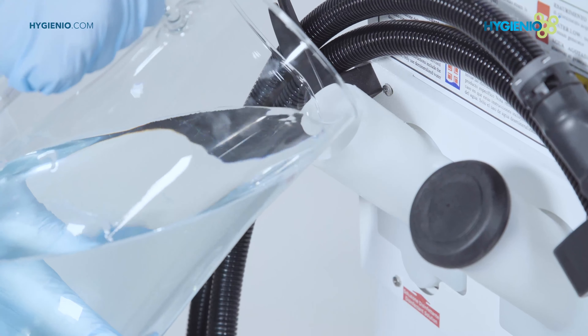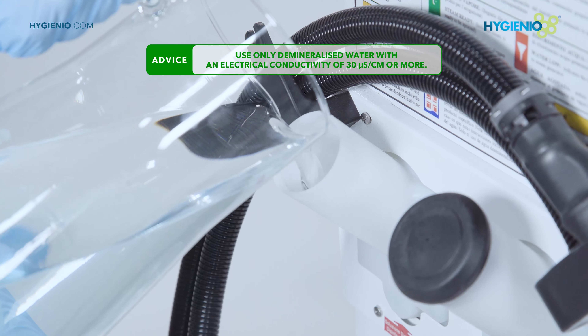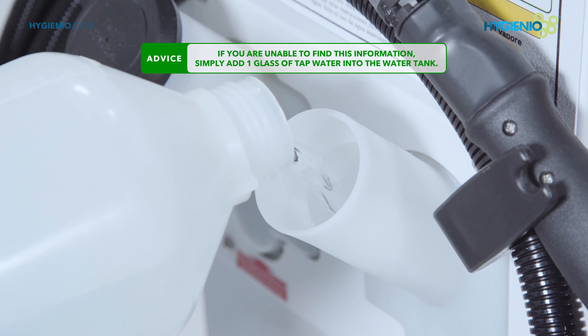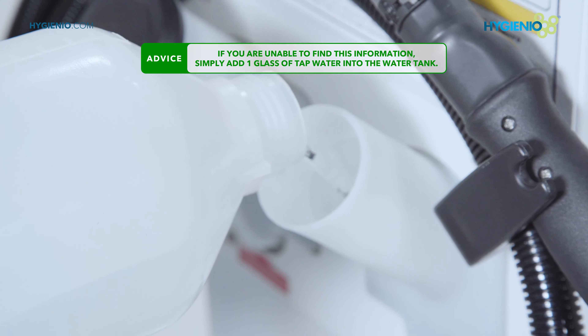Pour the prepared solution into the disinfectant tank. Fill the water tank with two liters of demineralized water that has an electrical conductivity of 30 microsiemens per centimeter or more.